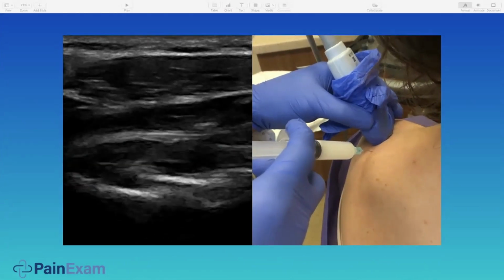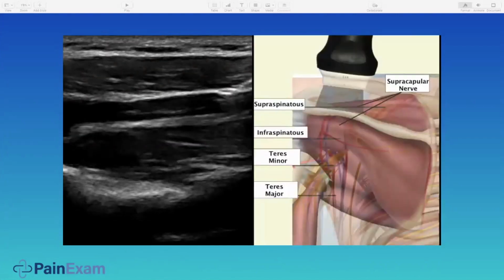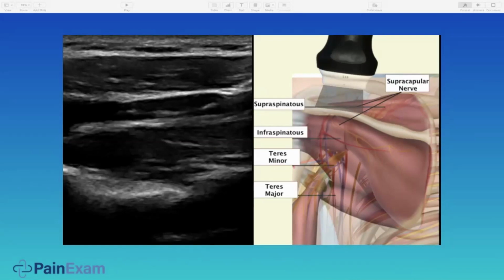It's a mixture of 10 to 20 milligrams of Depo-Medrol. Use dexamethasone, or there are even studies showing that you can use just local alone and get long-term relief, which is what I'm doing with my brittle diabetics or patients who've had enough steroids. And it's working extremely well. When you do this block more in the patients, their arm may be weak afterwards. The other thing I've noticed with this block, patients will sometimes report, oh, my hand is feeling warm and numb, or my radicular pain in my arm has gotten better.